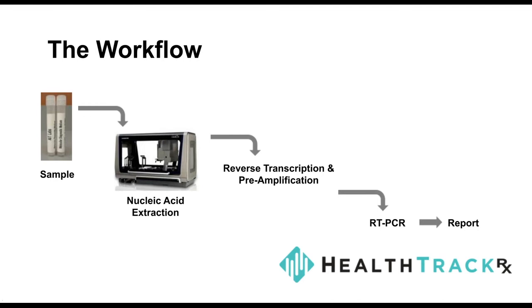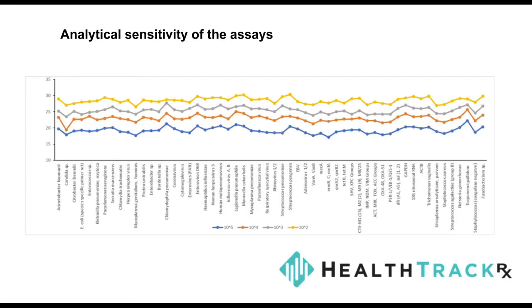Okay, looking at some of the examples with respect to the performance characteristics. And herein, I would emphasize the point of working closely with your assay manufacturers. One of the biggest stumbling blocks that labs face in developing any extensive panels is finding the reference material that you'll use to establish some of those test characteristics. And it can be very, very difficult to find true relevant reference material. So the manufacturer that we worked with was able to provide us, in a timely fashion, all of our target sequences at a defined known value.